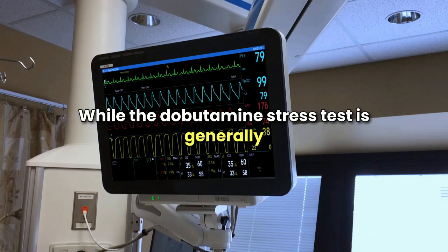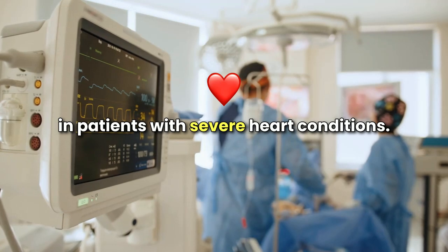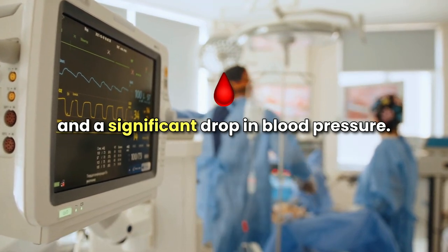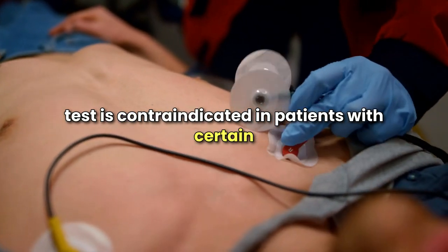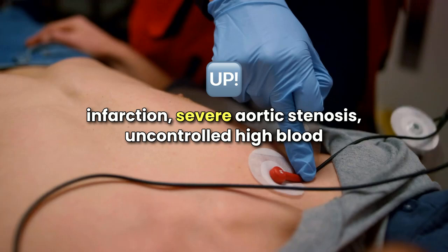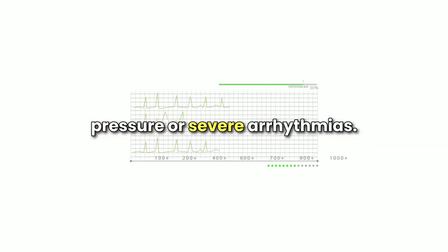While the dobutamine stress test is generally safe, it does carry some risks, particularly in patients with severe heart conditions. Potential risks include arrhythmias, chest pain, heart attack, and a significant drop in blood pressure. It's also important to note that the test is contraindicated in patients with certain conditions, such as unstable angina, recent myocardial infarction, severe aortic stenosis, uncontrolled high blood pressure, or severe arrhythmias.